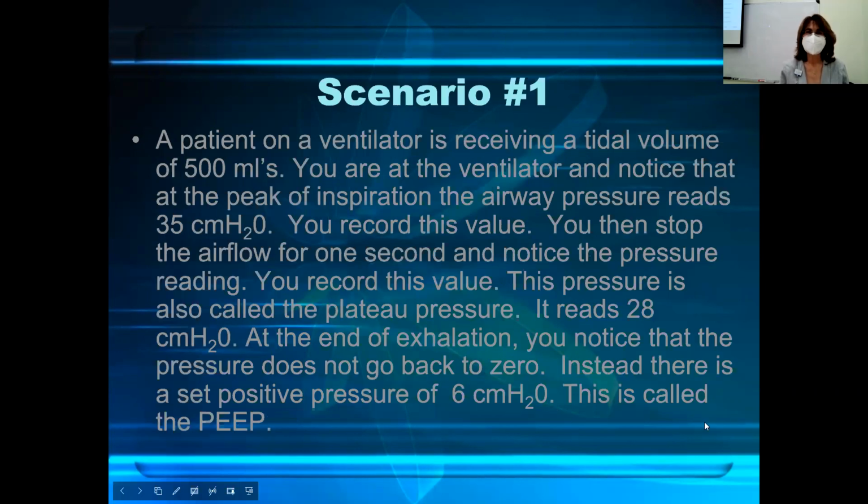All right, so now we're going to apply that information. We have a patient on a ventilator receiving a tidal volume of 500 mLs. You are at the ventilator and notice at the peak of inspiration, the airway pressure reads 35 centimeters of water. You record this value. You then stop the airflow for 1 second and notice the pressure reading, and you record this value. This pressure is also called the plateau pressure. It reads 28 centimeters of water.